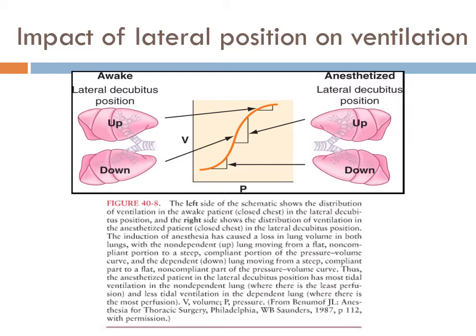potential right here if you can find that sweet inflection point to get that curve to go up, but you really are going to have much more wiggle room here. And that inflection point basically is when you're starting to think about over-distension of the alveolar spaces, which is going to cause what kind of trauma? Barotrauma, right? Or volume trauma, depending on how you look at it. But barotrauma being pressure, volume trauma being too much volume, but too much volume is going to eventually cause high pressure. So it's all kind of the same thing, just different ways they can categorize it, putting a great effort in for nothing. You're not going to get a lot out of being at the top of that curve.